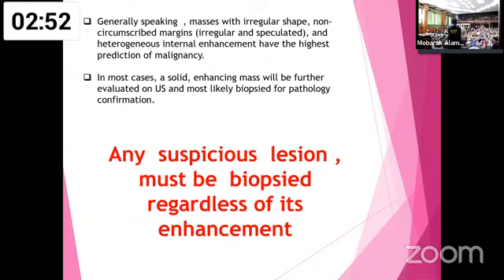Generally speaking, masses with irregular, non-circumscribed borders with heterogeneous internal enhancement are the highest for malignancy. Red flag: any suspicious mass, whether it is enhanced or non-enhanced, biopsy should be performed, as low-grade malignancy can present as a non-enhancing mass.